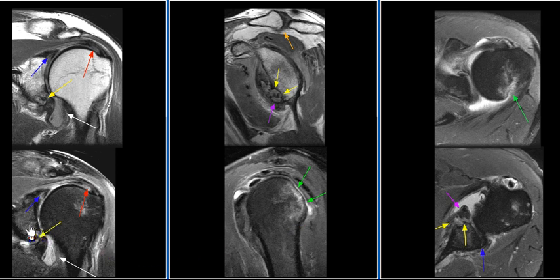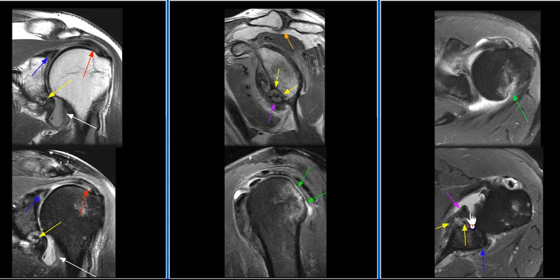There is a fracture of the anterior inferior glenoid fossa with cancellous edema consistent with an acute or subacute Bony Bankart lesion with a bone fragment.